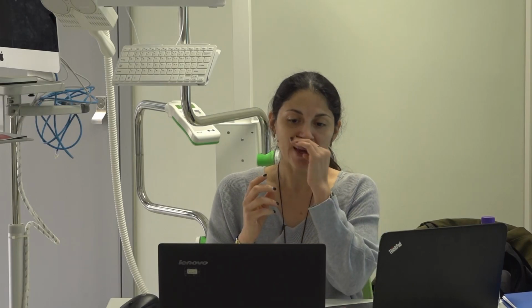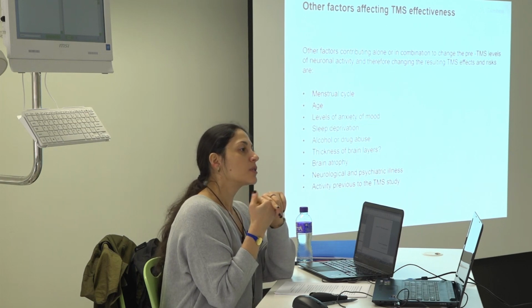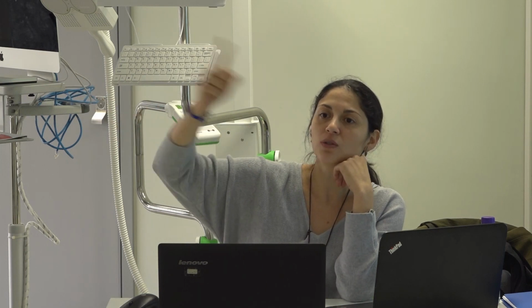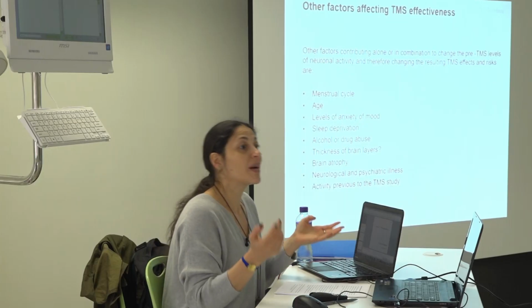Sleep deprivation. This is very important. There is one case that was reported as a cause of seizure, and it was a case of sleep deprivation for someone who did a trip from one country to the other, and he didn't sleep well, went to do TMS, had a session, experimental session, and had a seizure. So keep an eye on that. The person didn't have epilepsy before or anything, but it happened.